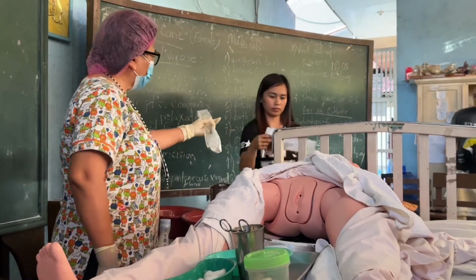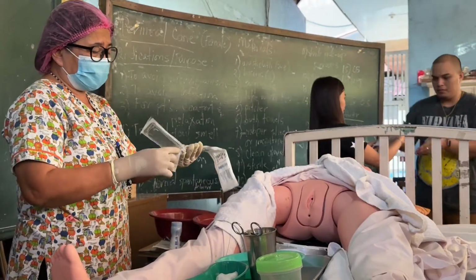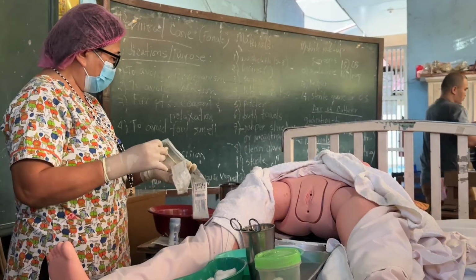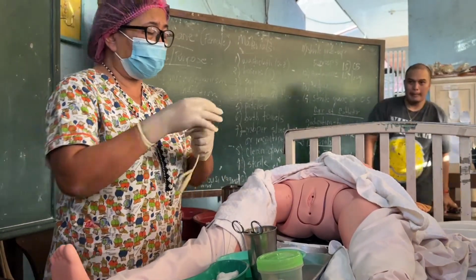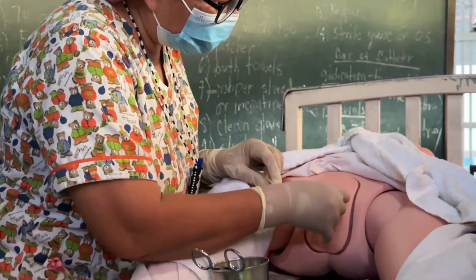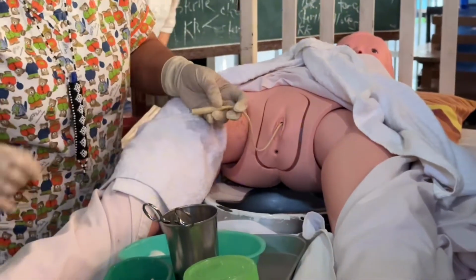So this is the Urobag, no? Kanang collection sa urine. So presuming that this catheter has been inserted at the urethra of the patient, no? So we don't do catheterization in situ, but we do the catheter care. So kani inserted na nisa sa urethra. Okay.